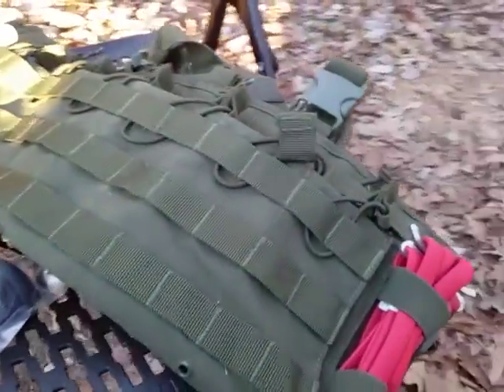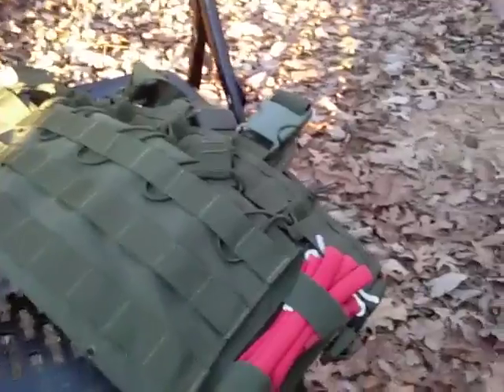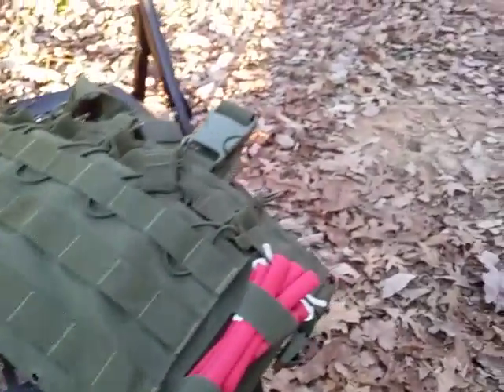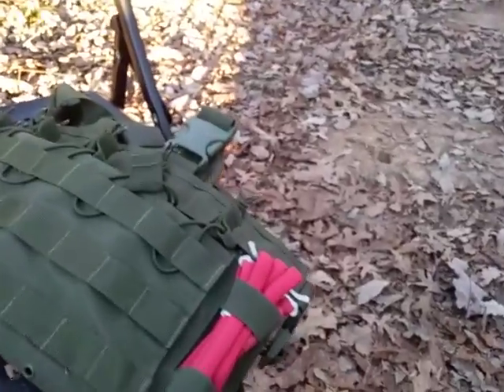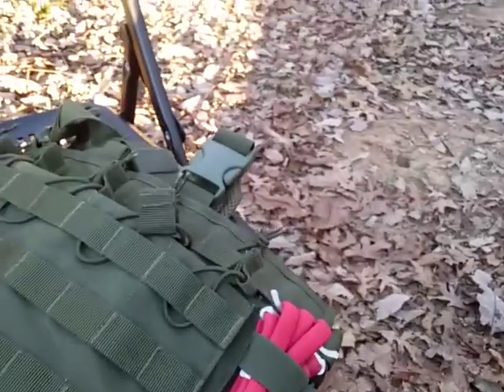It's always good to have a tourniquet. And in your main trauma kits, you really should have at least 2 in there, because if you did get hurt, a gunshot wound, for example, could go through 2 limbs, and you may need 2 tourniquets. So as a minimum, you really should plan on having 2 for a worst case scenario.